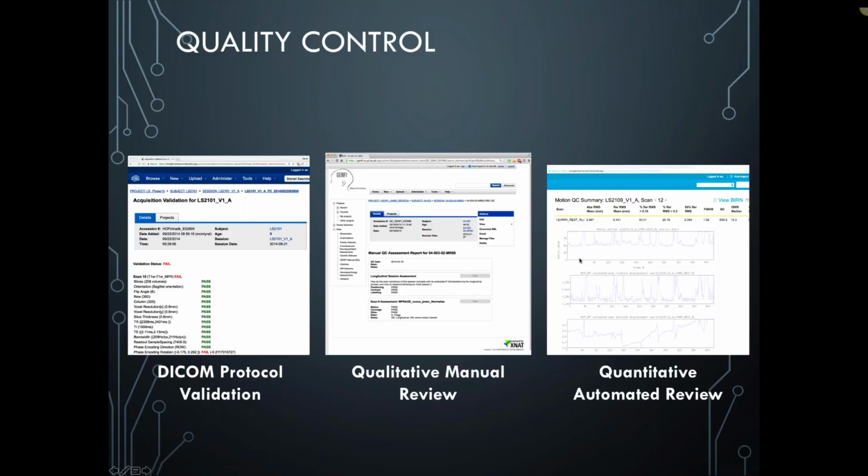So in this case, we're looking for motion artifacts in an fMRI scan, and you can see for this particular subject over time that they have a number of events where they're moving quite a bit. So this chart would indicate a subject who was really moving a lot in the scanner, and may need to be given instructions to hold still and rescan.